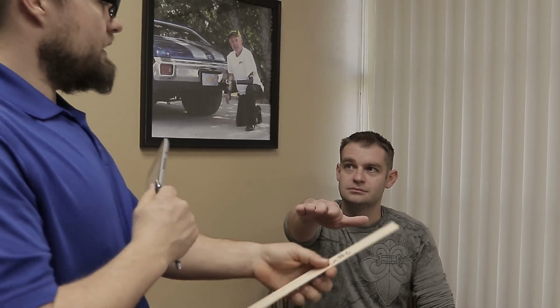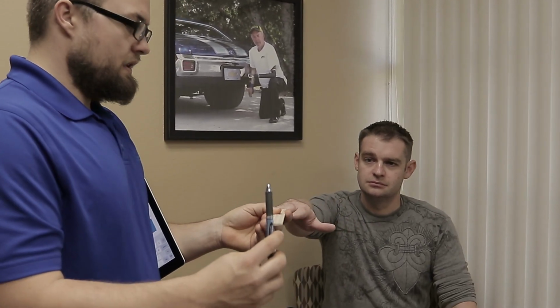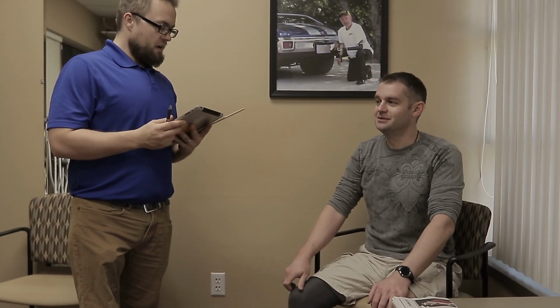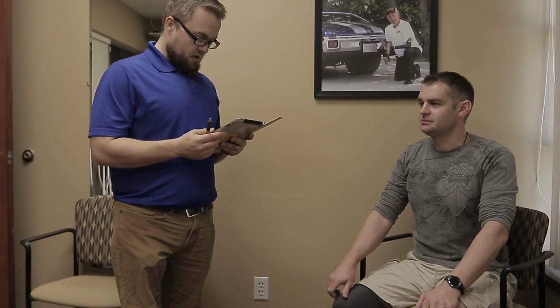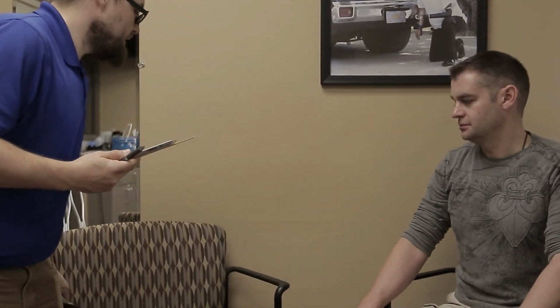Functional outcomes testing will begin at this point. These tests help determine the functional level of the patient with and without the use of a prosthesis. This allows us to track a patient's progress over time, showing improvements or deficits as they relate to prosthetic and physical therapy interventions, as well as physical or lifestyle changes by the patient. Changes may be made to the treatment plan based on these test scores.